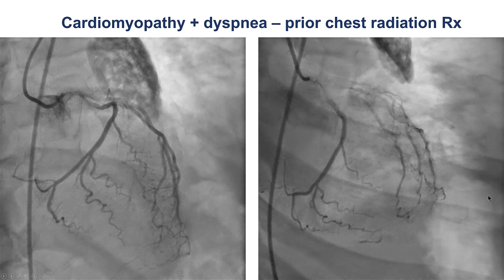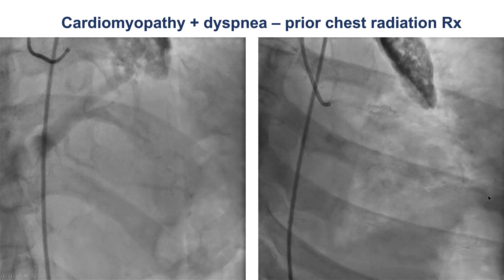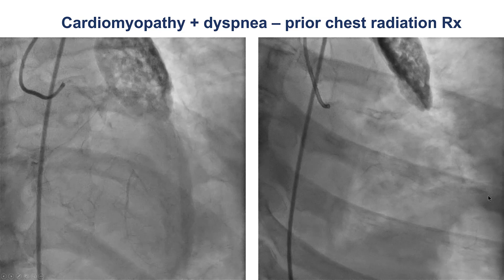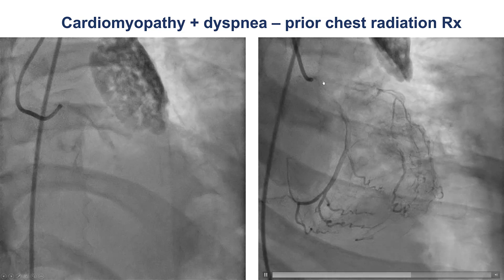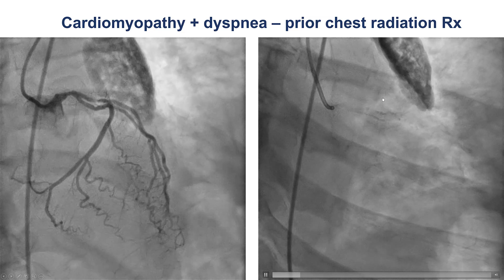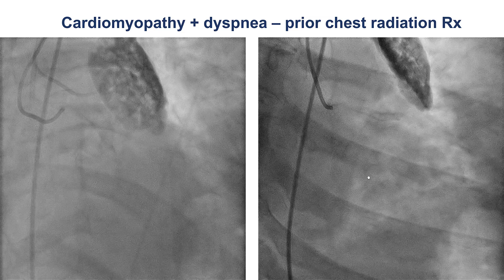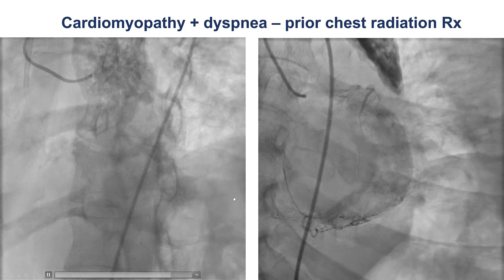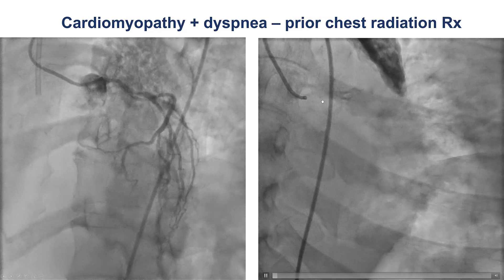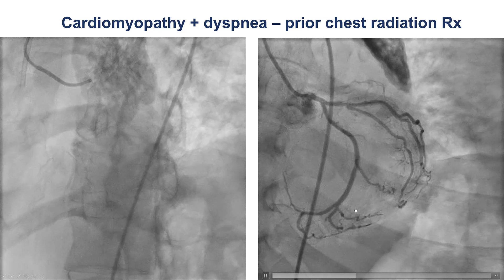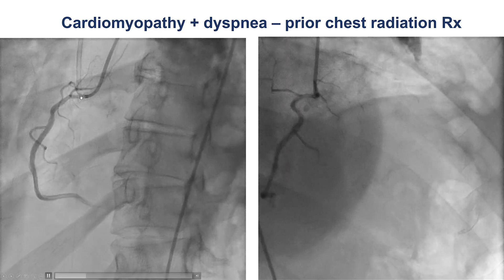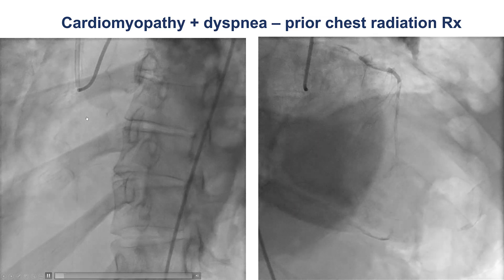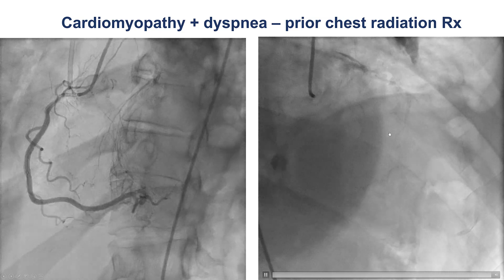The patient had previous radiation therapy of the chest for cancer and presented with dyspnea. She was found to have a cardiomyopathy, and coronary angiography demonstrated an ostial occlusion of the left anterior descending artery with heavy calcification. Different views demonstrate some filling in the LAD territory via ipsilateral collaterals. There is mild to moderate disease in the circumflex, and there was also a significant ostial lesion of the right coronary artery with dampening of pressure upon engagement, and with septal collaterals from the right filling the LAD.